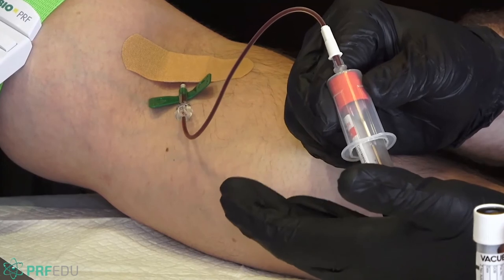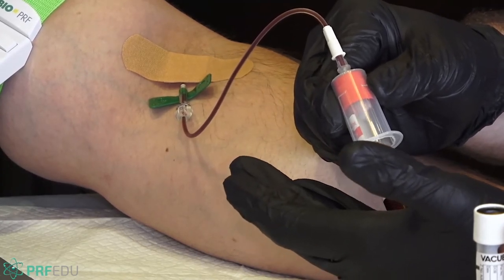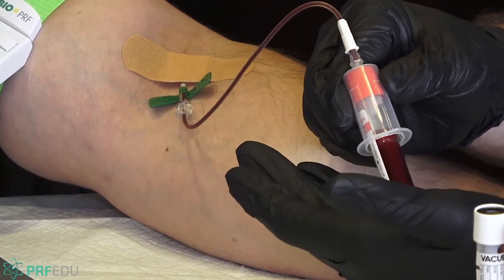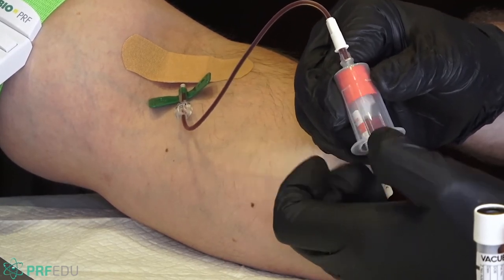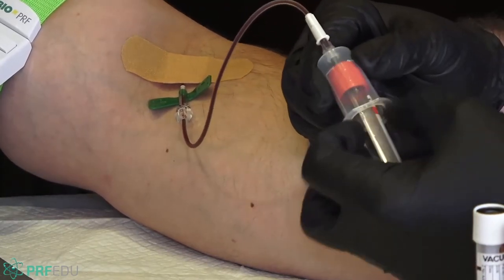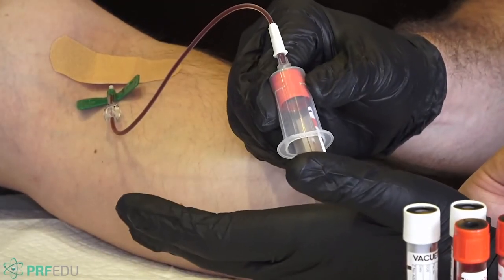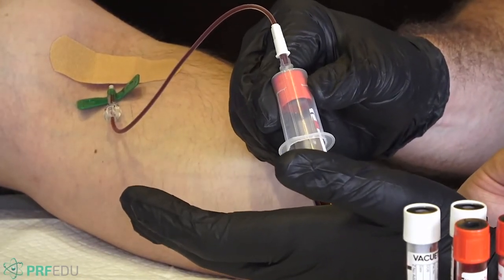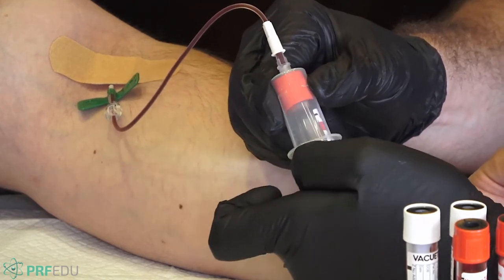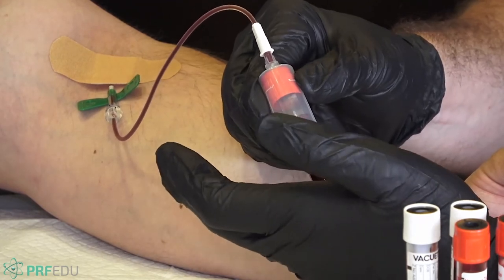Okay, so again, another thing that's important too with these blood draws, a lot of people wonder how many tubes can you draw, etc. Each one of these tubes is 10 cc, so 10 mLs. Typically, when you go to a blood bank, you're going to give 300 cc's, okay? So you can literally give 30 of these tubes, and that's equivalent to a blood draw. When I take 8 tubes here from Carlos, this is a very, very small amount, so there's nothing to worry about. And you can always inform your patient about that as well.